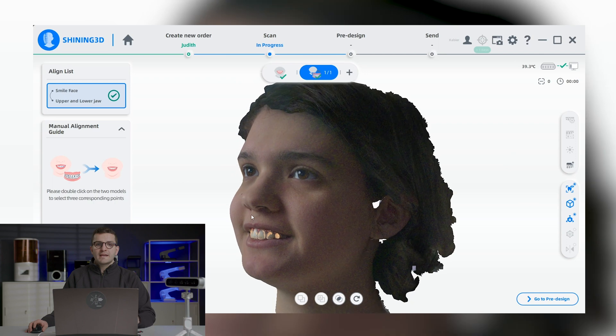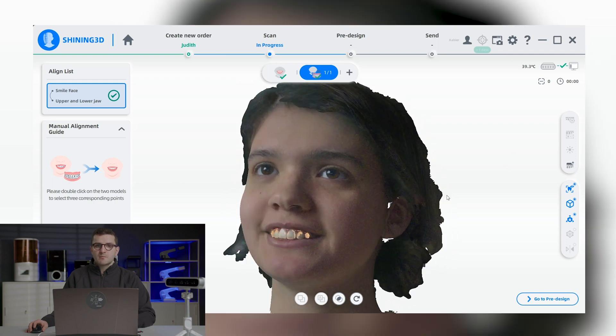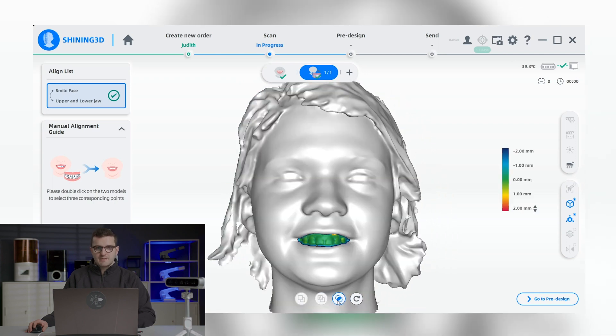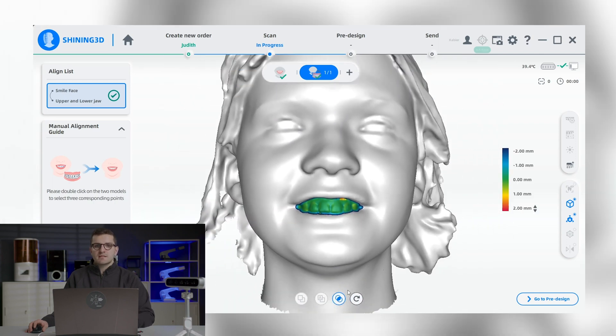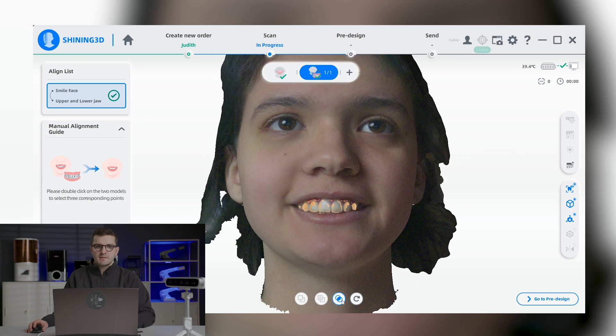We can now go to the pre-design phase. In this phase, we can use exactly the same editing tools as in the previous scanning stage.